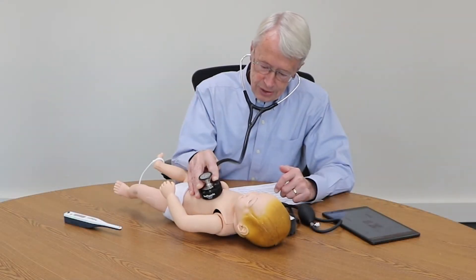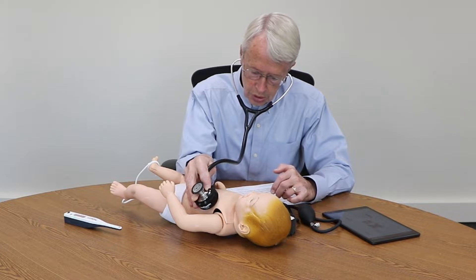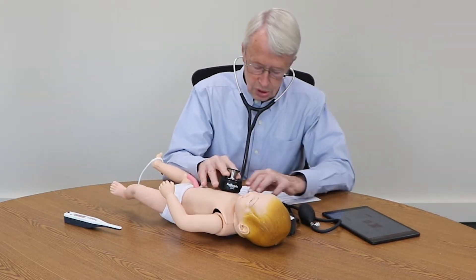When it comes to conducting newborn physical assessments and measuring infant vital signs, experience is essential. That's why we created our Infant Vital Signs Trainer.